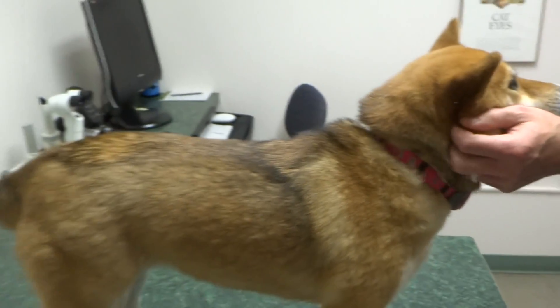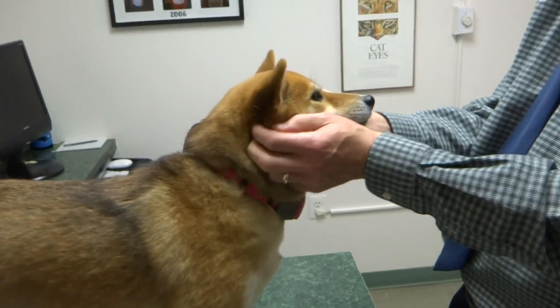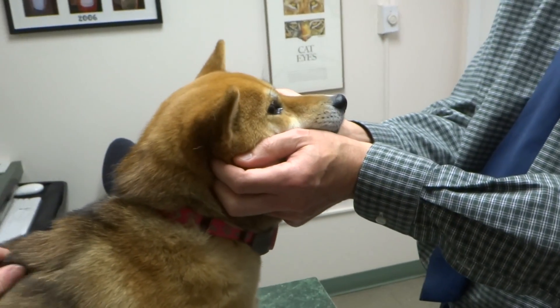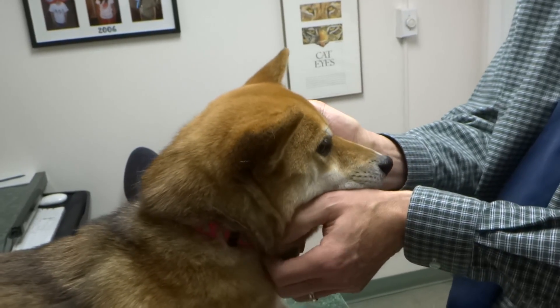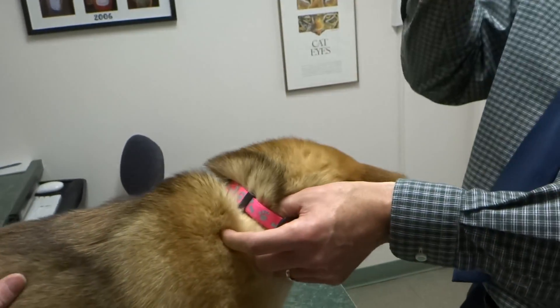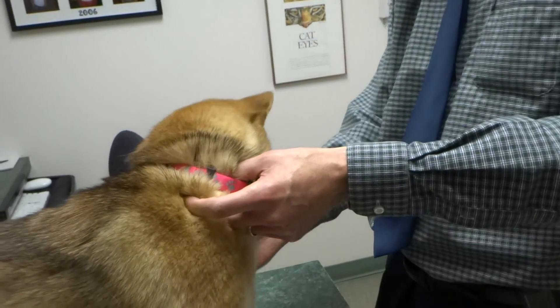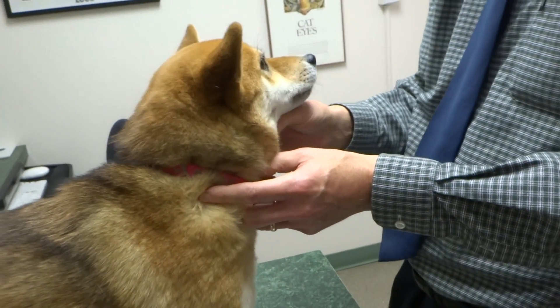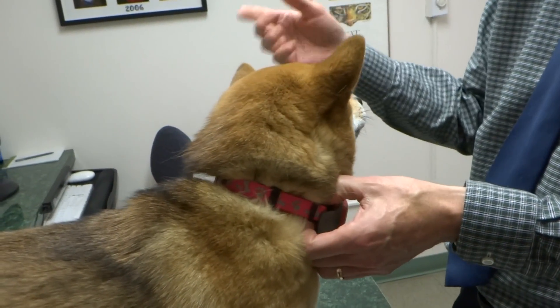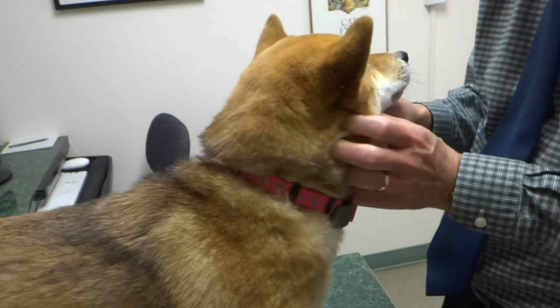So basically, the anesthetic wears off in about 30 to 40 minutes. The lubricant — we'll wipe some of it out because if it dries around the lid later on, it'll look a little bit whitish. If you see some of that, don't worry about it, just use a warm wet cloth. But I'll try and wipe some of it away. It's a normal lube we use for eyes — it's like a gel for moistening eyes. So it's supposed to be in there.